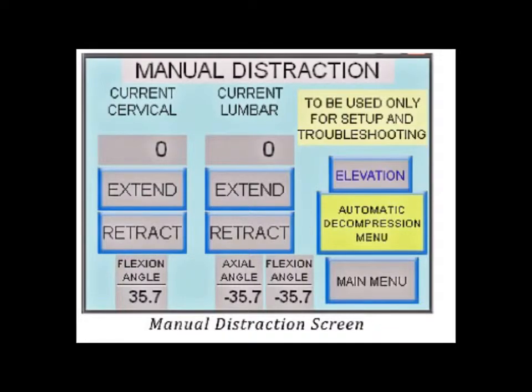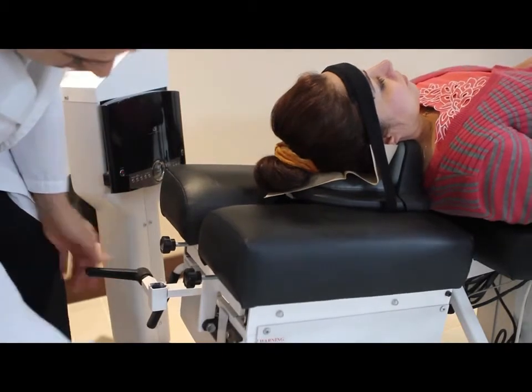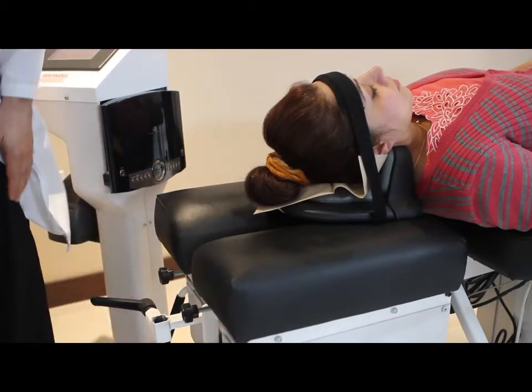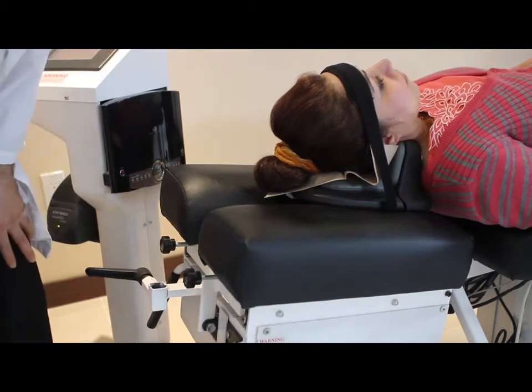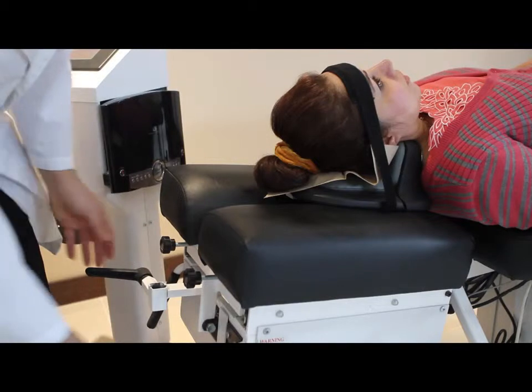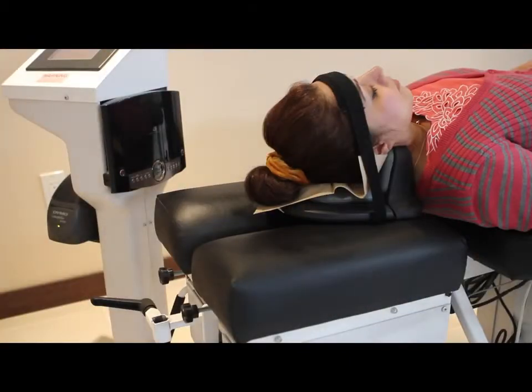Always describe what the patient should experience by doing a manual traction chosen from the touchscreen using a few pounds. Next is to pick the positioning, program and number of cycles. According to the cervical anatomy, the more flexion on the headpiece, the lower the cervical vertebrae being affected. So when the headpiece is at 0 degrees, we are decompressing the upper cervical area, and when we add flexion, we are addressing the lower cervical area. It is hard to say the exact level, but always try to find the most comfortable position for the patient while asking if their radiculopathy is minimized.